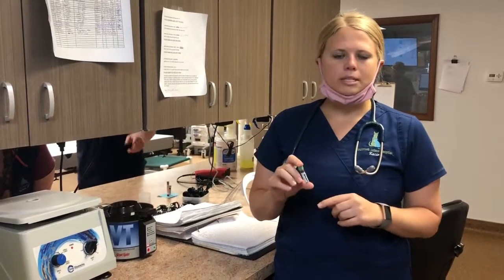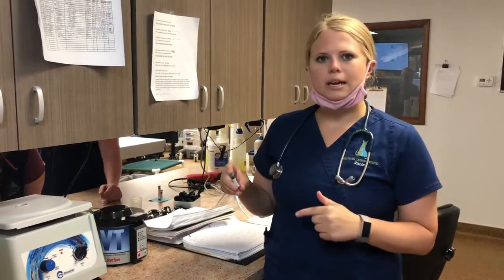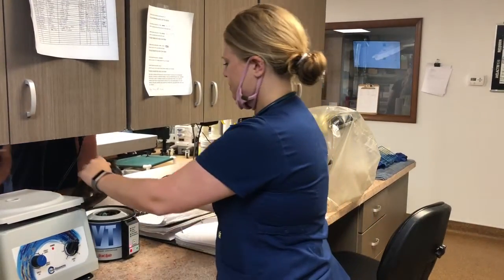For this video, I'm going to demonstrate how to run a blood chemistry Chem 10 panel. I've got a whole blood sample as a pre-anesthetic in the tube that's pre-treated with heparin. I'm going to spin it down in our centrifuge in order to get the blood serum to use for the panel.